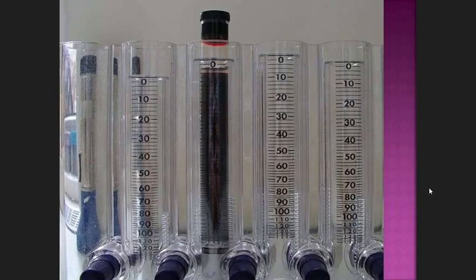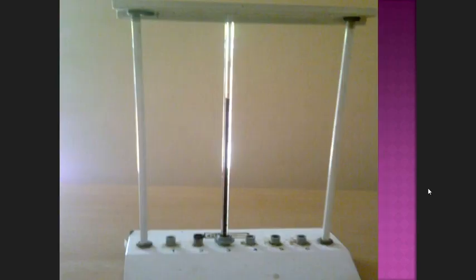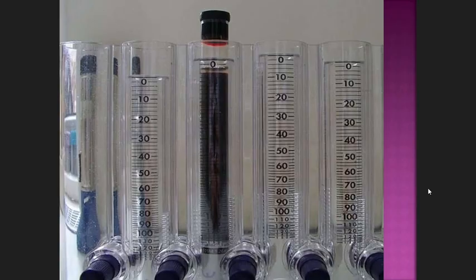Okay, so who will tell what is this? Anyone? These are tubes. Which is this tube? Westergren tube. Yeah, these are the Westergren tubes. Okay, and this one? Any idea?